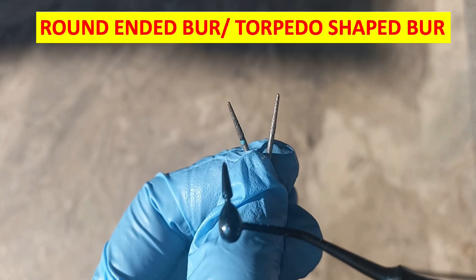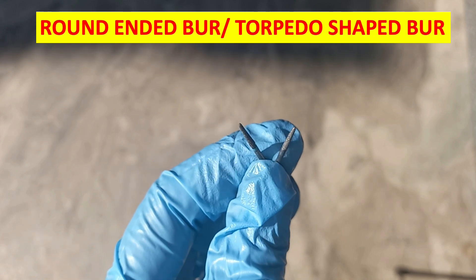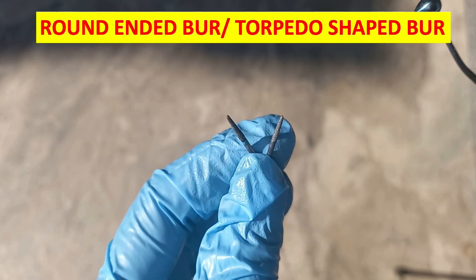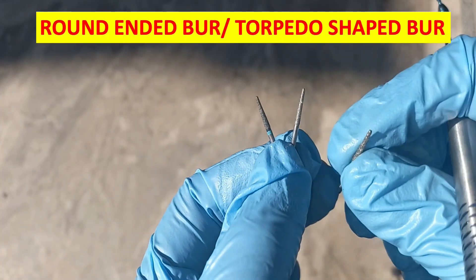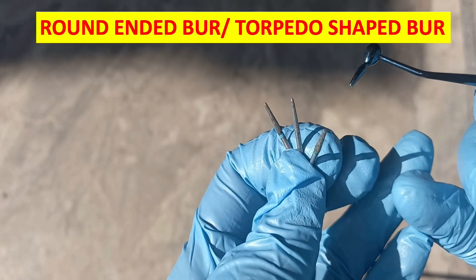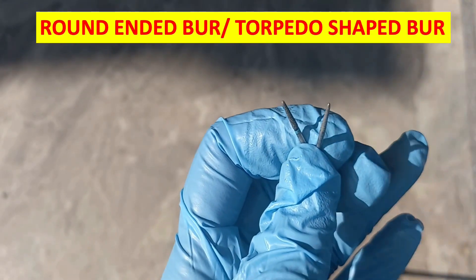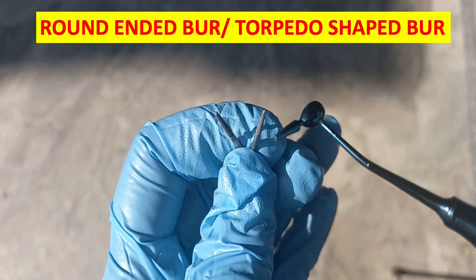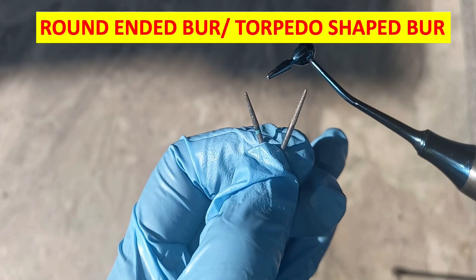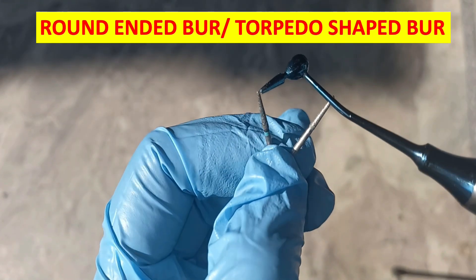As you can see in the figure, the first one we have is the round-ended bur, also called the torpedo shaped bur, and the tapered flat-ended bur. One bur is tapered and flat-ended, and the other two are tapered and round or torpedo shaped. These burs are used for the chamfer line preparation, whether for deep or simple chamfer line preparation.